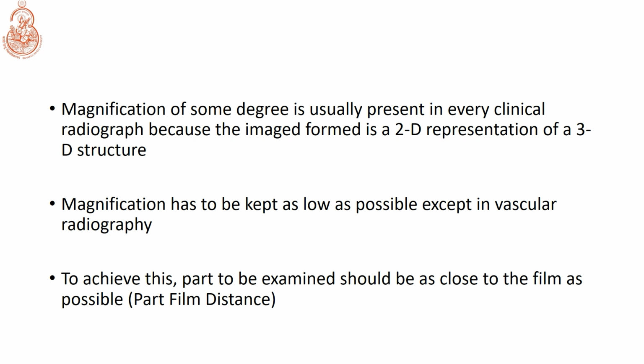Magnification of some degree is usually present in every clinical radiograph because the image formed is a two-dimensional representation of a three-dimensional structure, which means that the abdominal cavity has different organs which have a 3D structure, which has a thickness, and we are going to get a radiograph which is a flattened image, a 2D representation of a 3D structure.